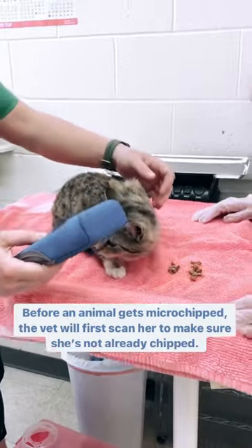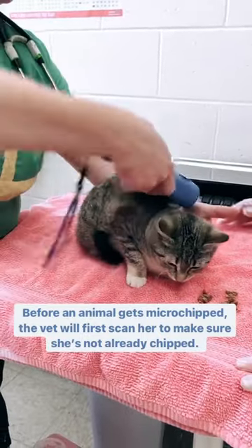Before an animal gets microchipped, the vet will first scan her to make sure she's not already chipped.